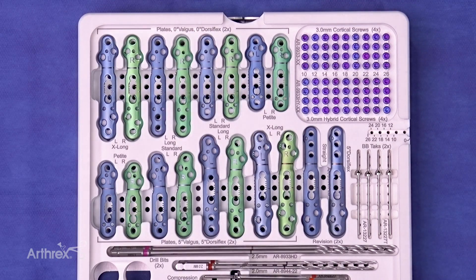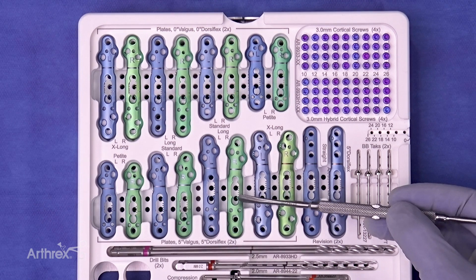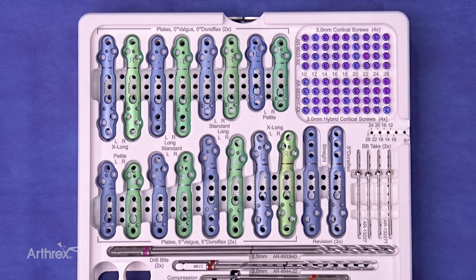The new MaxForce set will fit conveniently into the current CFS set, which houses your reamers and other instruments needed. The new MaxForce plate utilizes new technology to increase compression. We have a gear mechanism that provides first-time compression and second-time compression throughout this oblong compression geared hole.